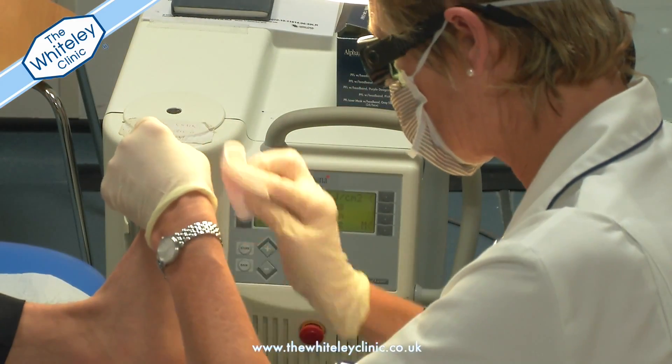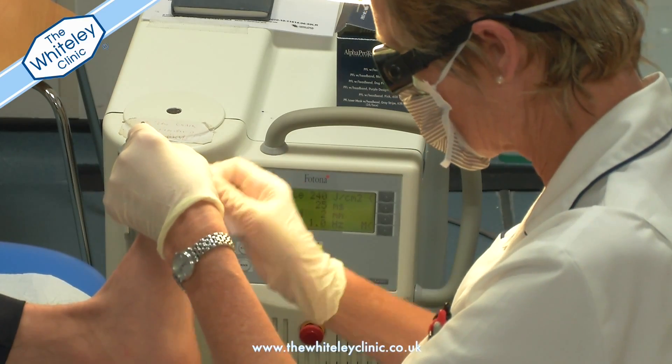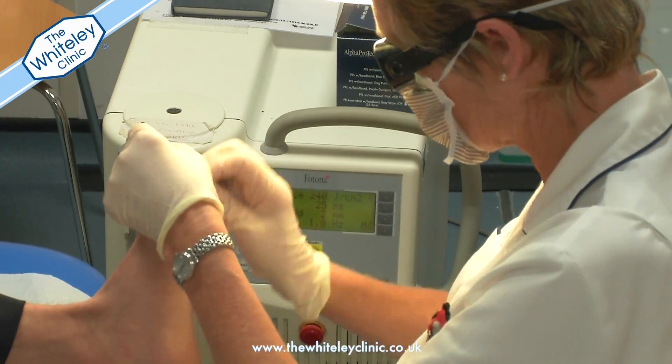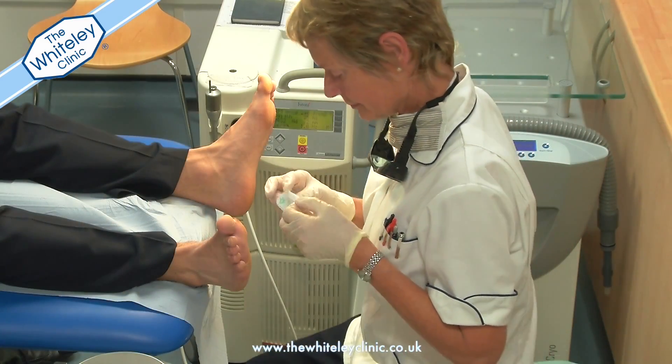When the area has been covered two or three times with the laser beam, the area is then cleaned and covered to avoid any type of infection or bacteria entering into the treated area.